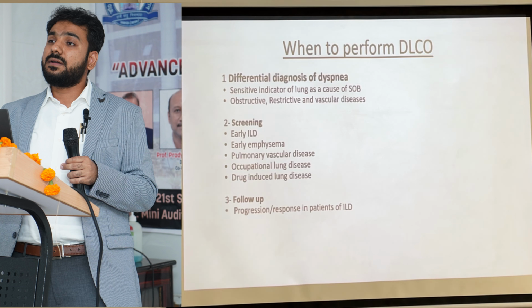Third, obviously, is follow-up, progression or response to treatment. It is used in ILD patients to see the severity and how they are responding to treatment and the progression of the disease. And fourth is obviously assessment of severity. In COPD, ILD, and PH, the severity of DLCO impairment is directly related to survival. So it is used in that.